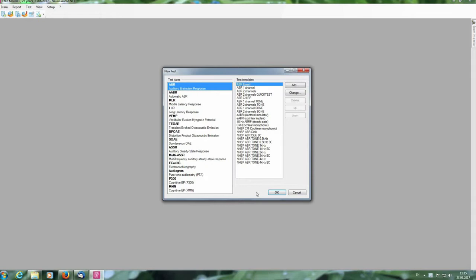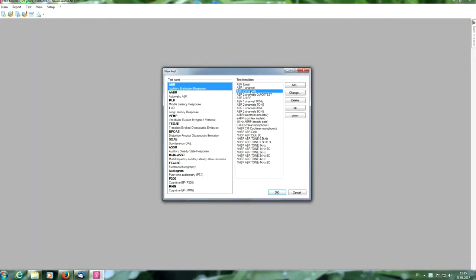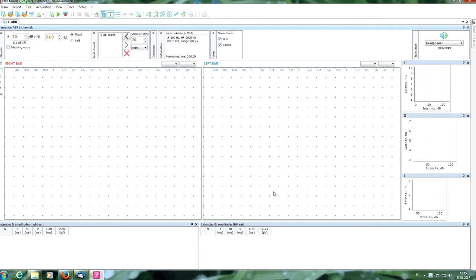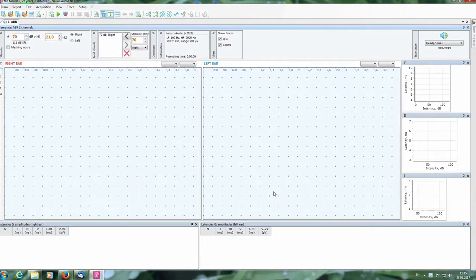Now we can see a lot of prepared templates for performing different types of tests. We need to choose the necessary one, for example, ABR for two channels template and press OK button. Now we are in the main program window for this test.